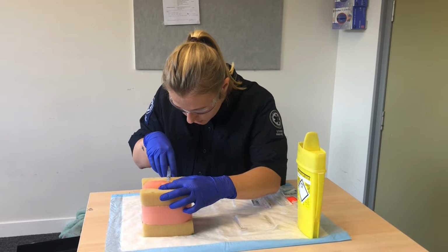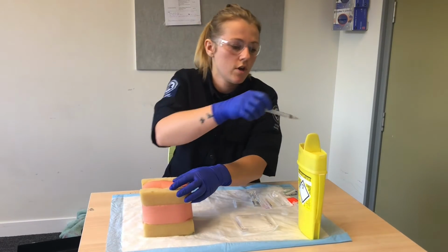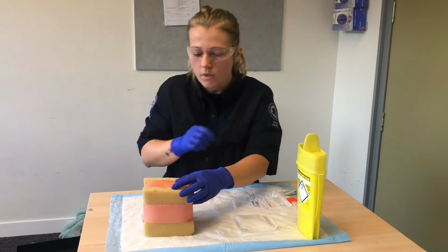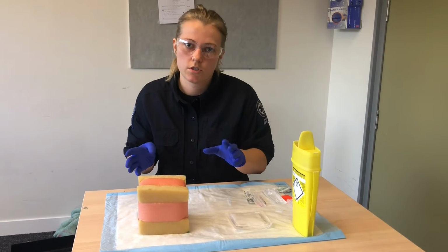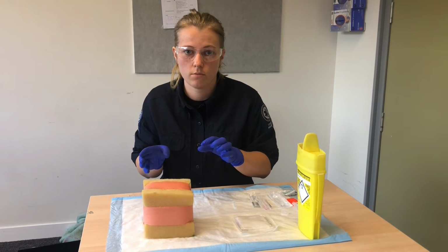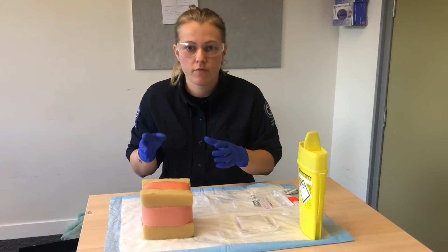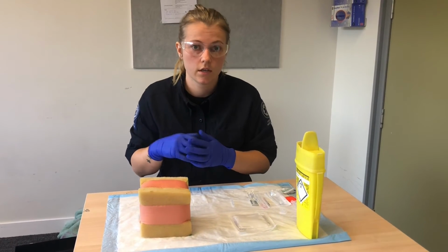So I ended up injecting all that 1 ml, and I want to remove it and put it straight into the sharps container. And I'm just going to make sure to watch the patient just to make sure there's no adverse effects, and I also want to wait 1 to 2 minutes before I gain IV access so that the lignocaine can work.